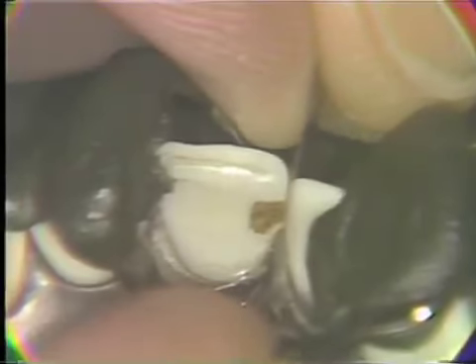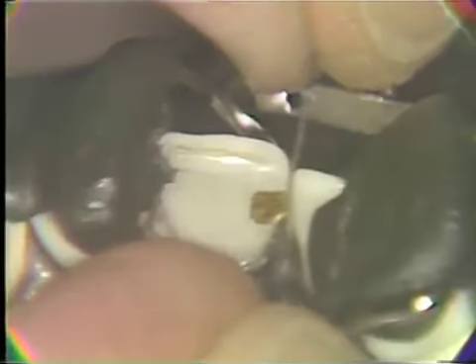With the acrylic matrix now removed, we've applied the Ferrier separator and have that, of course, locked into position with compound in order that we can use a lightning strip to break the contact area that we have and remove the bridge of gold that we see from tooth number 8 on over to number 7. So with this slight separation now that we have, working the strip from an incisal to a cervical area to again dislodge that slight excess of gold, and we're now just about through that contact area.